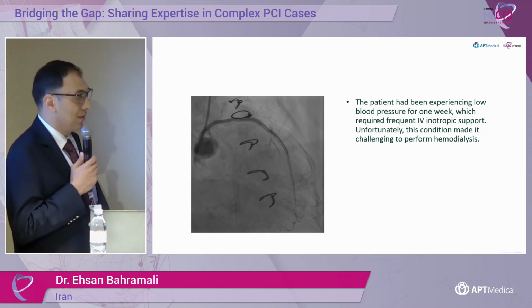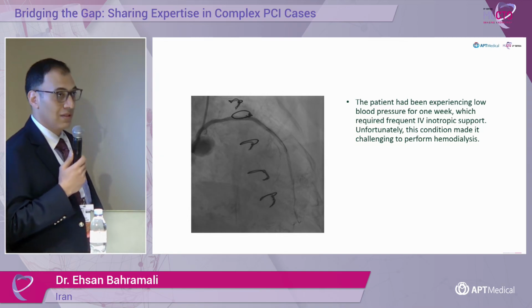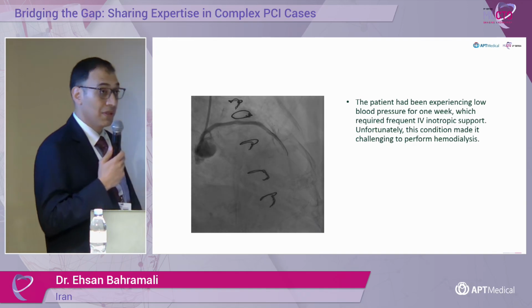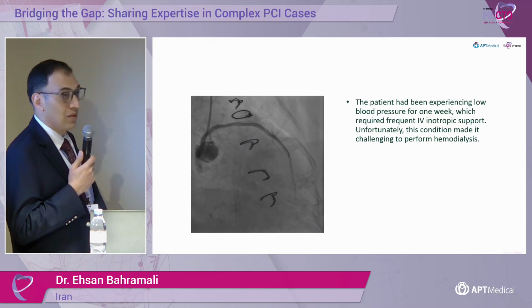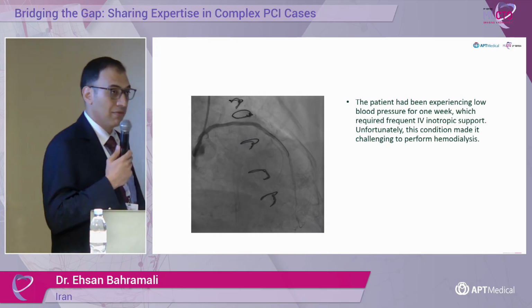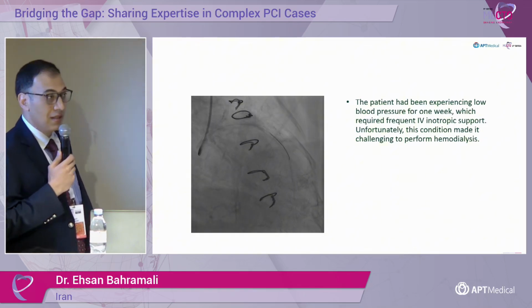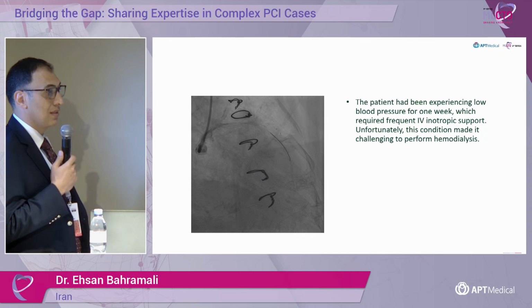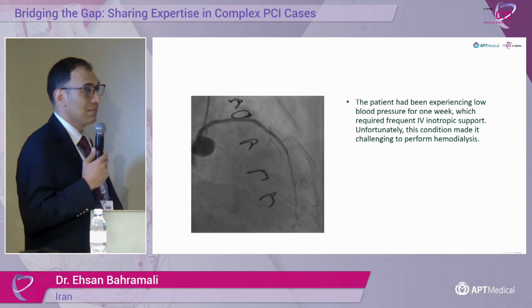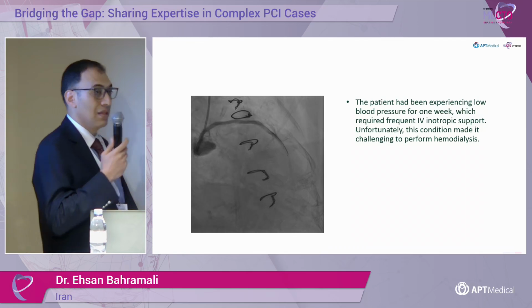Yes, she's right. We are hesitant to stent anastomosis sites. In my experience, the restenosis rate is very high, and that's why we go for the native vessel, with the risk of restenosis being very high. Yeah, the problem is that it was also calcified. So you need to have a perfect result for a drug-eluting balloon. So most of the time you will have some dissection or something, so you need to stent.